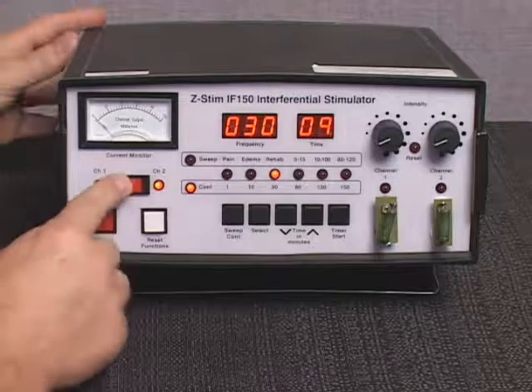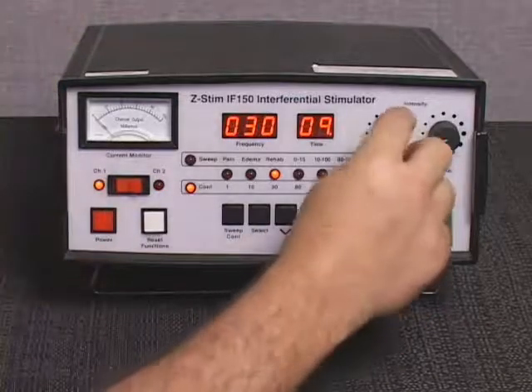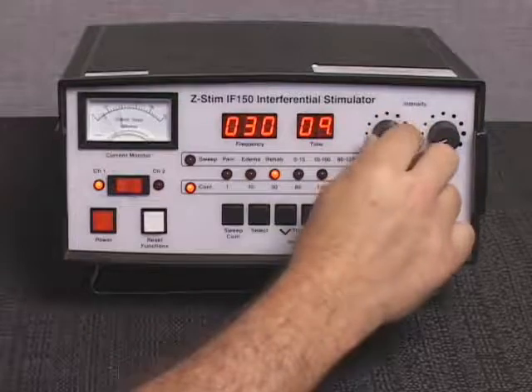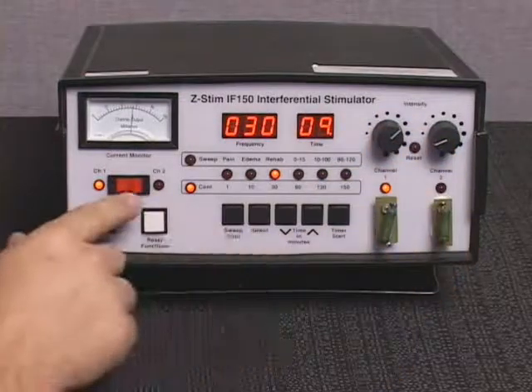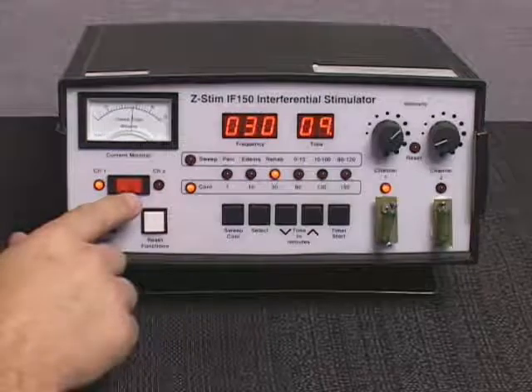Press the left side of the current monitor channel selection control. The current monitor indicator light for channel 1 will illuminate and the current monitor will display the output for channel 1. Slowly increase the intensity control for channel 1 to the desired output level. The current monitor will indicate the output intensity selected for channel 1. The output level for channel 2 must not vary more than plus or minus 20% from the output level of channel 1.